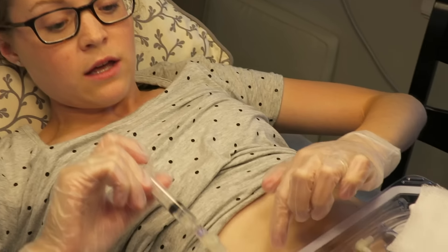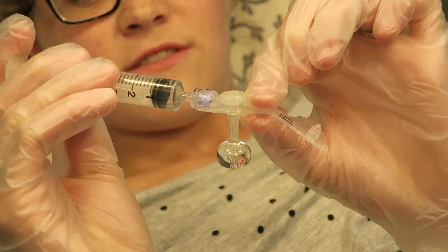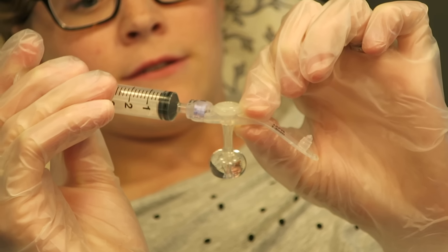So this is what's gonna go inside of my stoma. That is amazing. That is so cool. We've never actually been able to see what it's like.